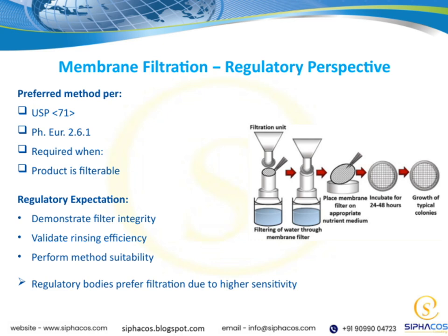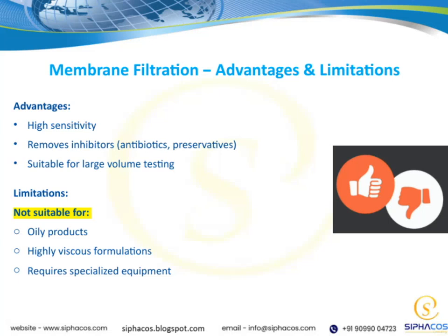Let's take a closer look at membrane filtration and its advantages and limitations. First, on the advantages side, one of the key benefits is its high sensitivity.